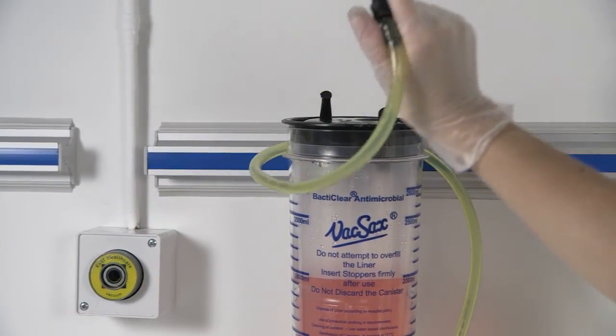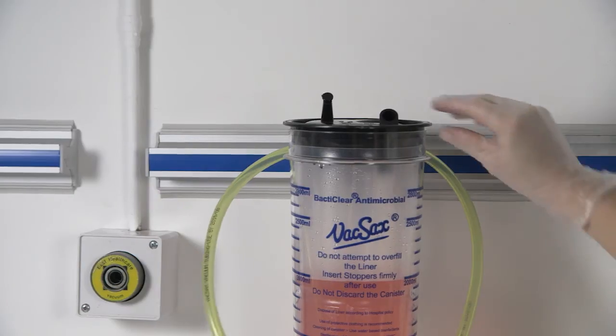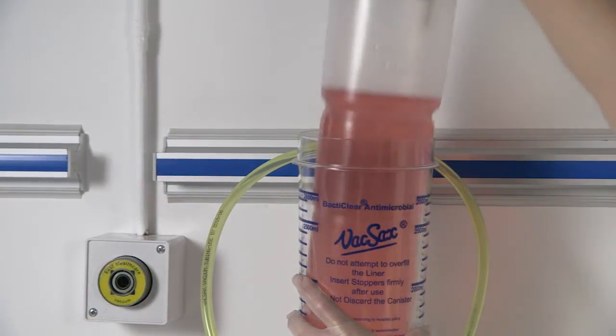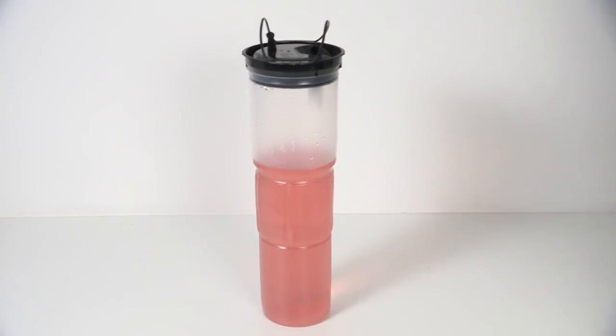Remove the vacuum tapered connector from the top of the liner, remembering that there is no requirement to cap off the vacuum port. This is due to the hydrophobic filter located within the liner itself. Using the convenient handles located at the sides of the liner, remove the liner from the canister. The VacSax BactiClear antimicrobial liner stands upright when full of fluid for convenient and safe disposal.